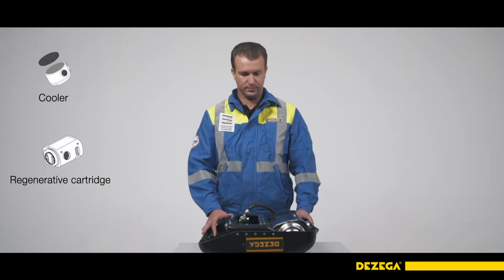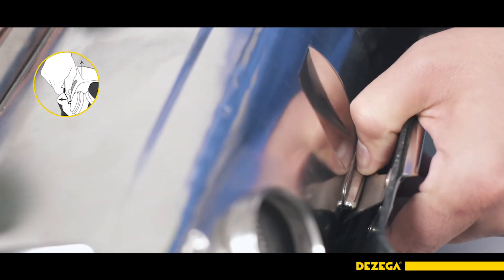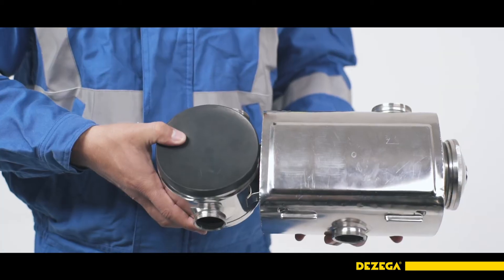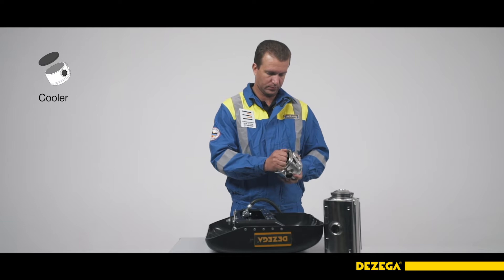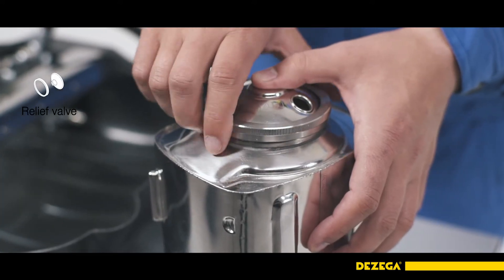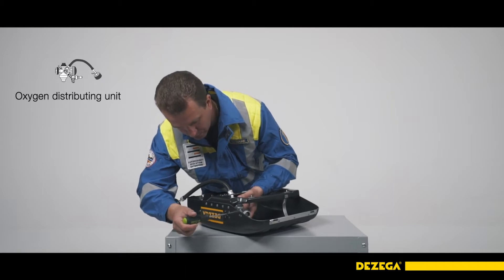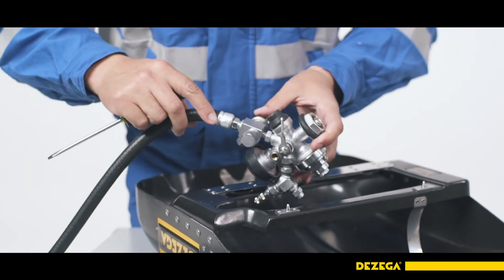Disconnect the breathing bag from the cooler and the absorbent cartridge. The absorbent cartridge is connected to the cooler via a bayonet connection. Press down on the regenerative cartridge clip and remove the entire breathing system while lifting the cartridge. Disconnect the cooler by turning it 45 degrees counterclockwise against the absorbent cartridge connection axis. Remove the cooler lid. Unscrew the locking nut and remove the relief valve. If checking or adjusting the oxygen distribution unit becomes necessary, unscrew the screw with a wasted shank using a screwdriver and disconnect the unit.